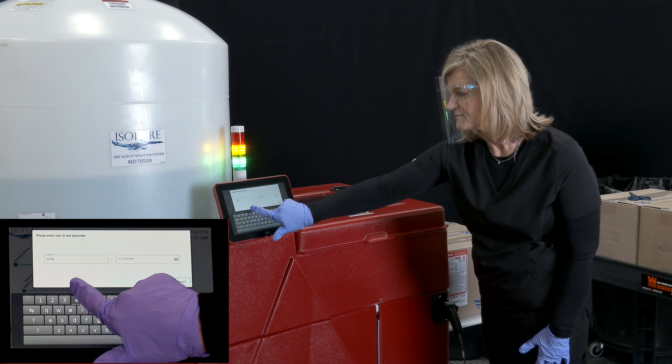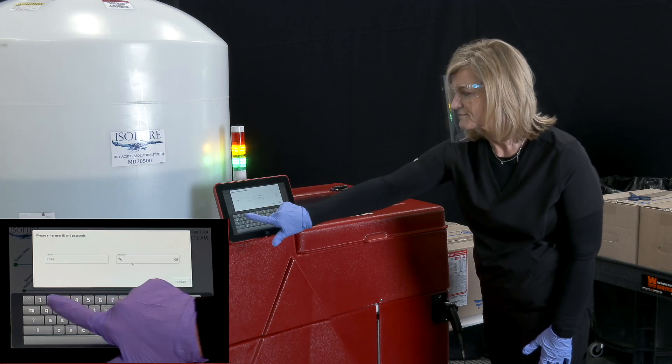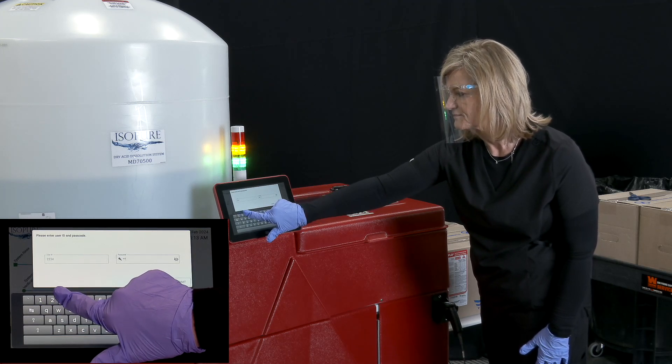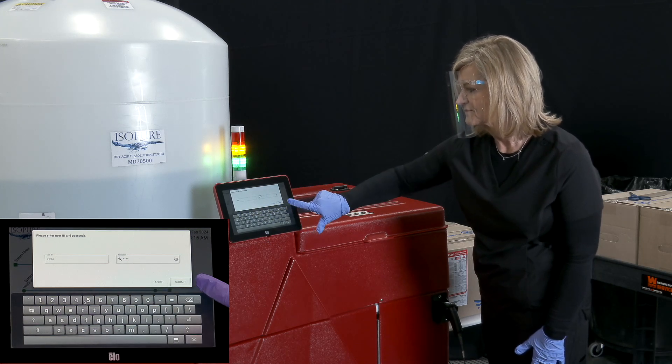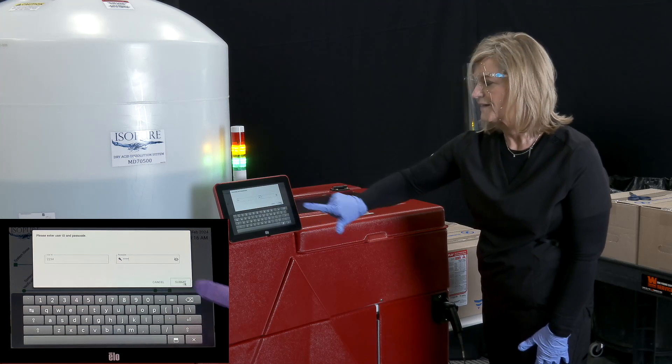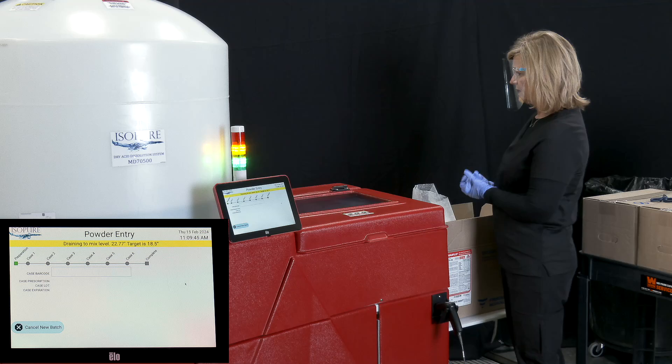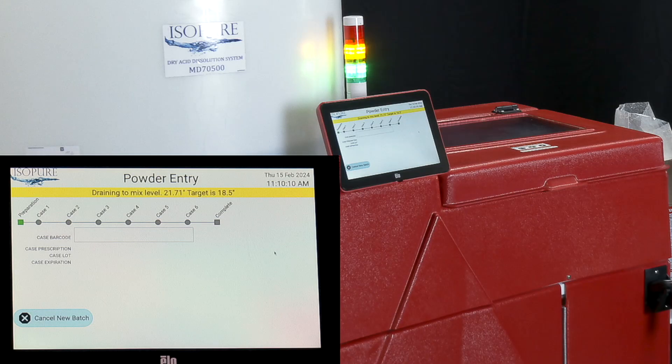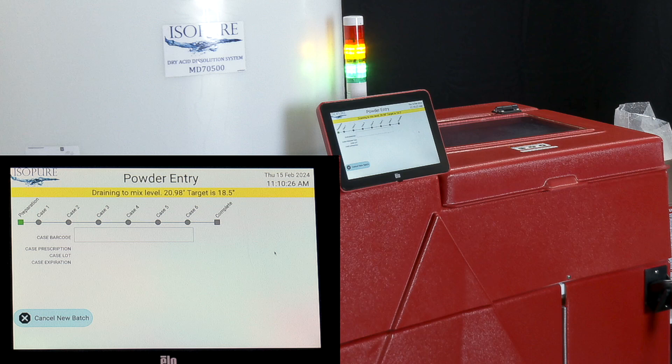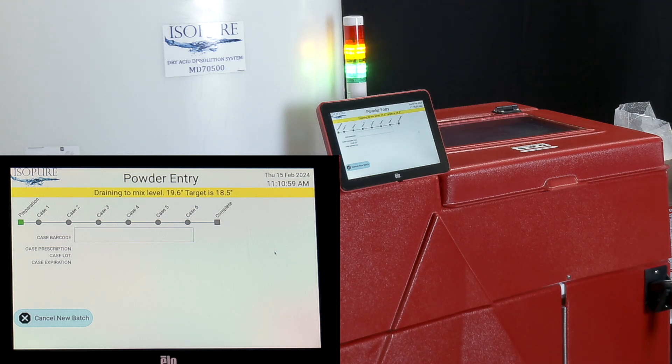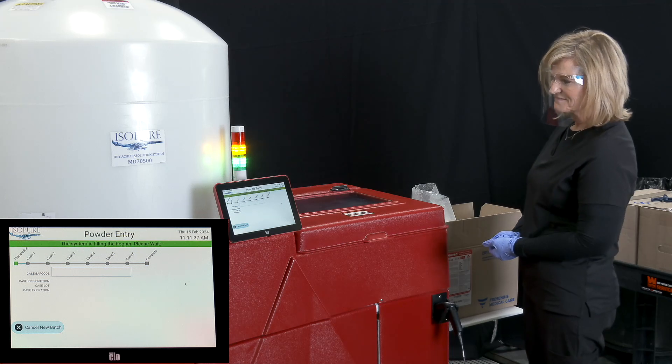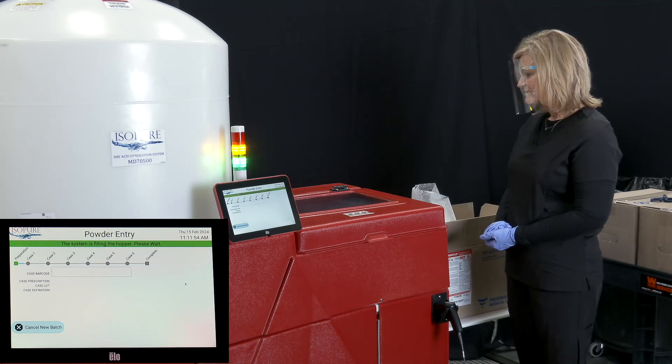Prior to scanning the first case of dry acid, the operator will again be prompted to re-enter their user ID and passcode. Acumix will automatically calculate the number of cases required based on the batch size you selected. This total case count is indicated on the initial powder entry screen. The shelf is designed to hold maximum two cases.